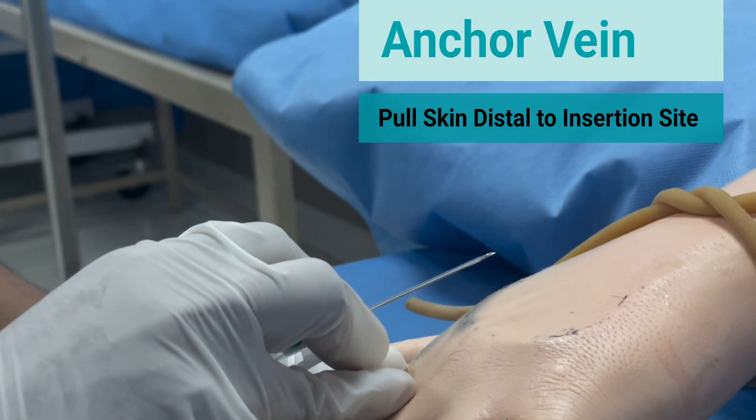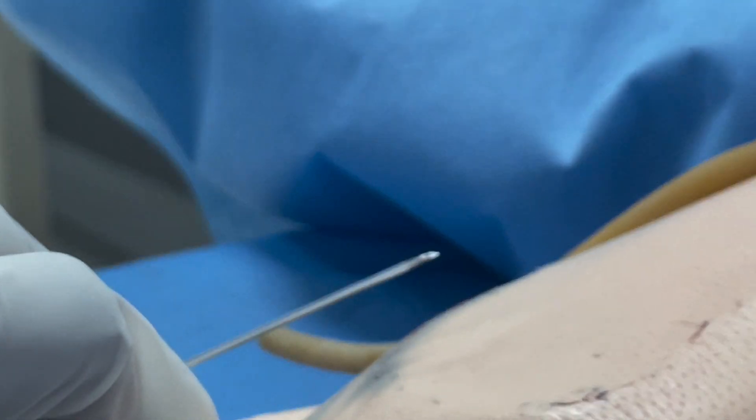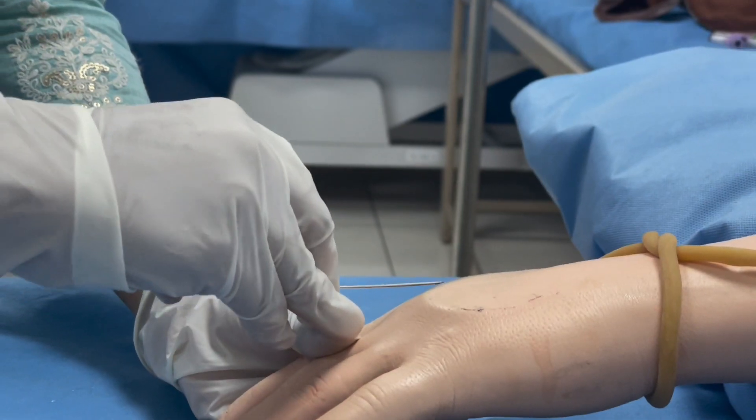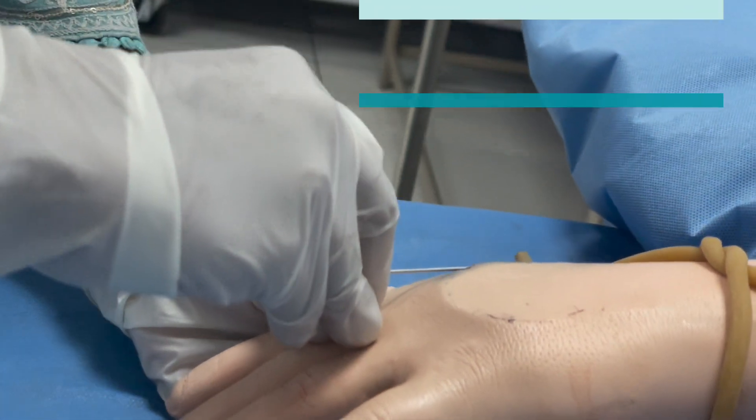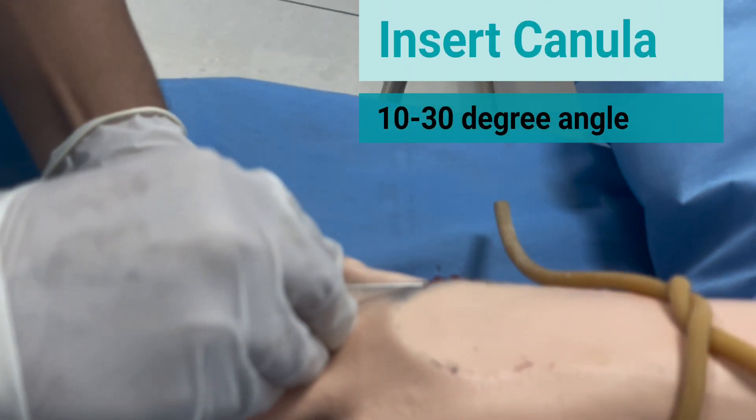Anchor the vein by pulling the skin distal to the insertion site. Insert the cannula at a 10-30 degree angle.